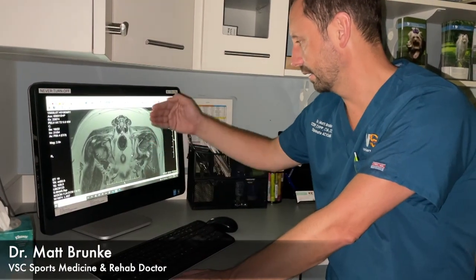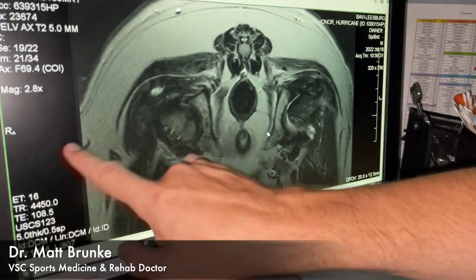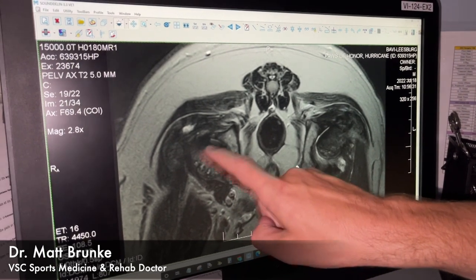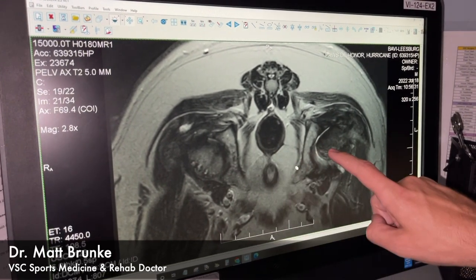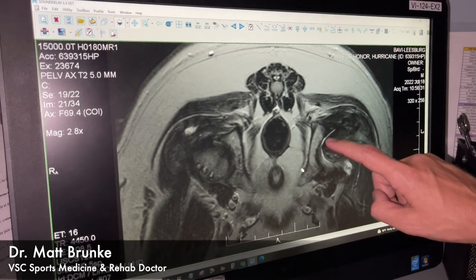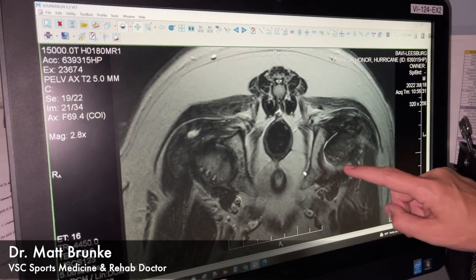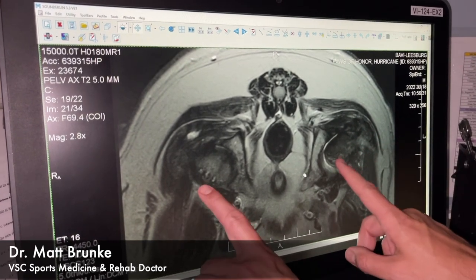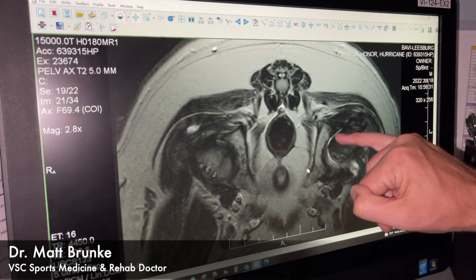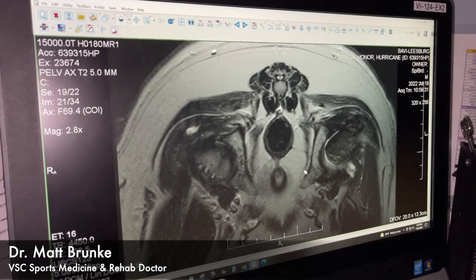Now we're looking at Hurricane as if we're slicing through like a loaf of bread. On the left side of the screen is the right hip joint, and that looks really good. The left one doesn't quite look the same, so it has us a little more worried about arthritis — unlikely to be infection or cancer, but there's a little bit more of a brighter spot on that side that we don't have on this side. We need to look at that with x-rays.